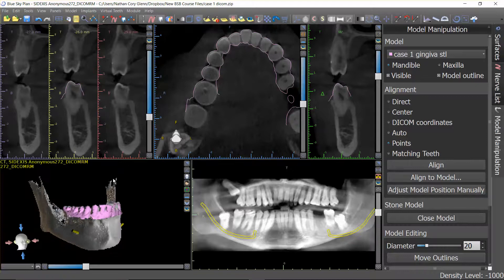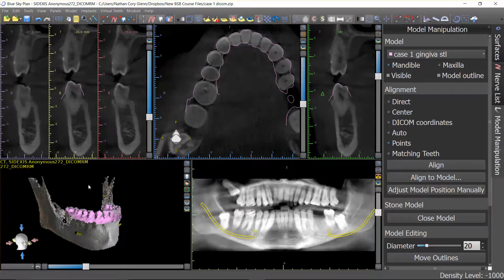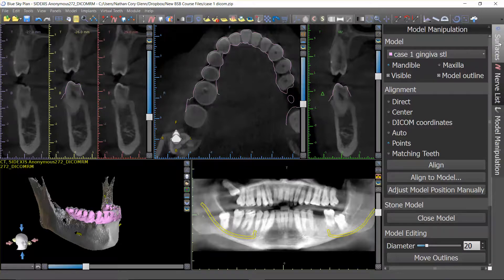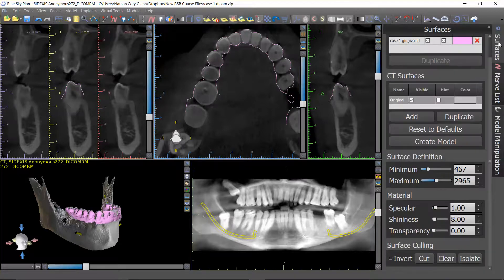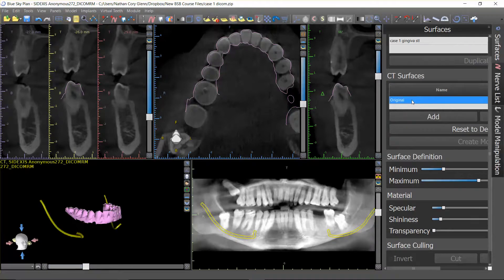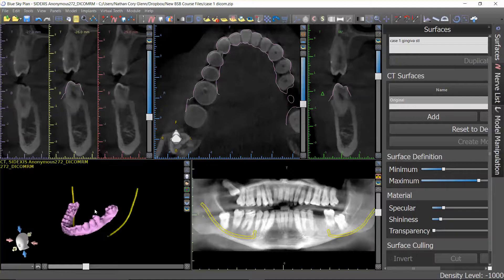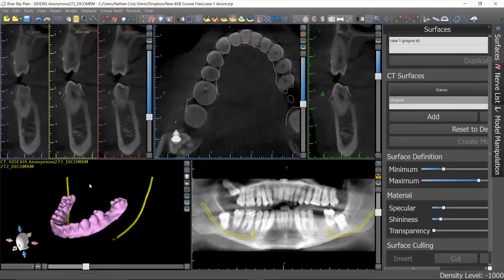Now we are ready to proceed with treatment planning on this case. We've plotted nerves and there's an STL model in position, so at this point I really don't need the 3D rendering of this mandible. I'm going to go to the surfaces panel. All of your surfaces — both STL and CT surfaces — are listed here. Under CT surface where it says visible, I'm going to uncheck that to take it out of view so I can just be looking at the clean STL data in the 3D rendering.